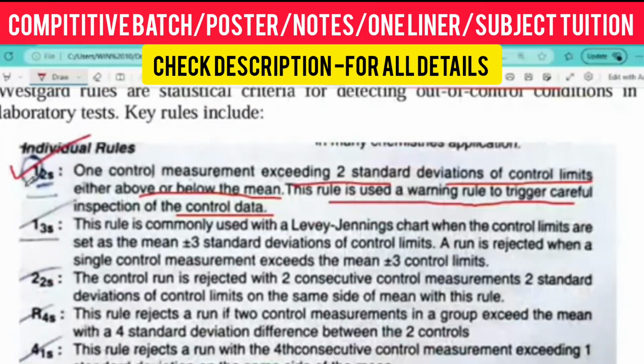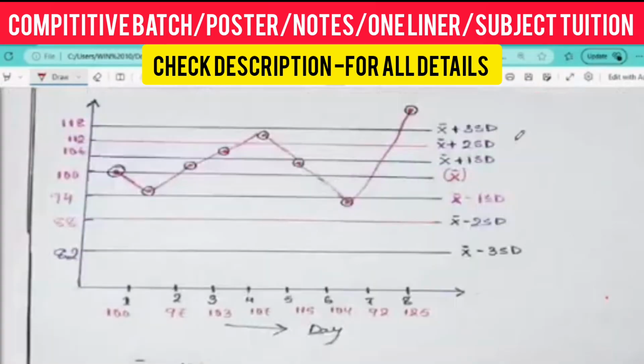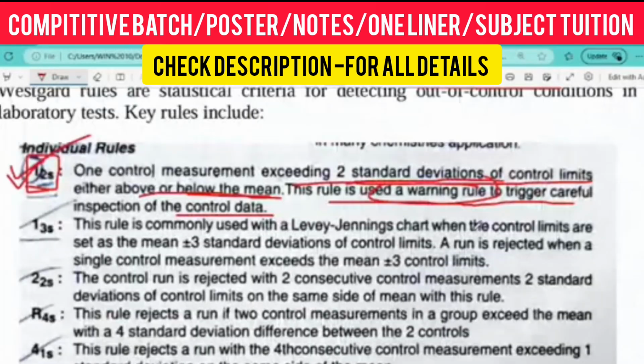Firstly, 1 2S, that is the first rule. If it exceeds 2 standard deviations above or below the mean, it is the warning rule, so we can accept this, but it's a warning. Getting my point? First rule: if it crosses plus 2 or minus 2, that is the warning rule. So the first rule is covered. Understood? If the graph crosses 2S plus or 2S minus, that is the warning rule. But the result is acceptable.